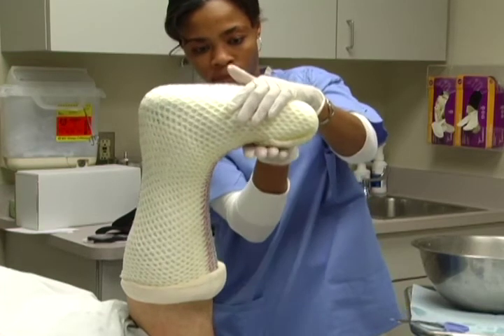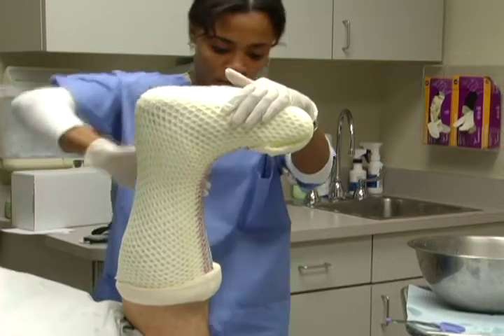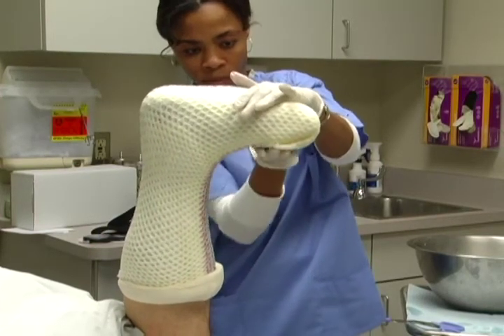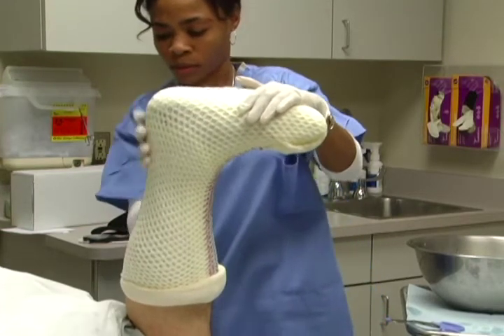Using wet gloves, contour the cast to the leg, ankle area, arch, and Achilles tendon. Continue maintaining the foot and ankle as close to 90 degrees as possible until the cast is firm enough to not change shape.